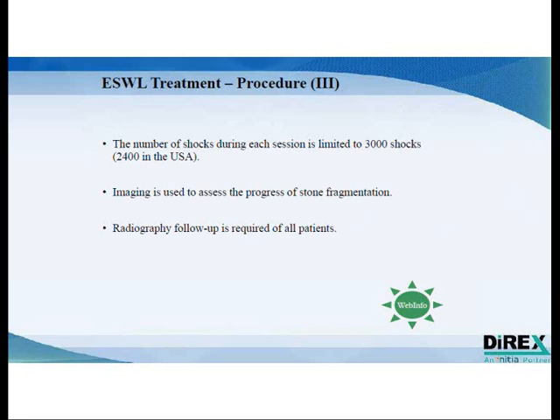The imaging, of course, is used throughout the treatment to assess the fragmentation of the stones and also to see if they have not moved. If you are treating a stone with shockwaves, you may influence its location, and you may want to follow up on the stone's location in order to make sure that you are aiming the energy at the stone and not at the soft tissue.